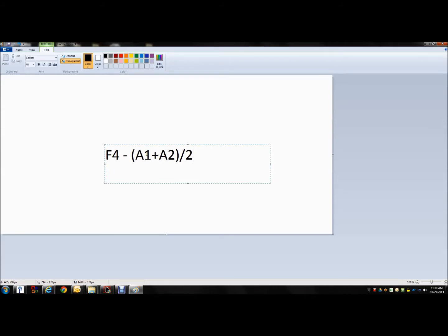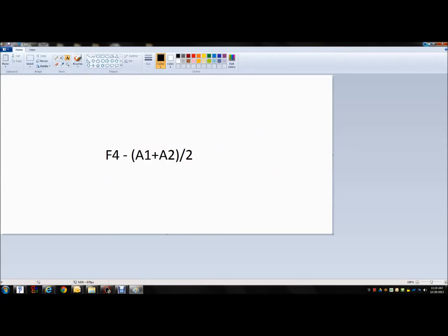It's a pretty neat tool. So remember that if you have a lot of EKG artifact in an ipsilateral ear reference, try using the linked ear, which is A1 plus A2 divided by 2. So you're getting the average of these two in input 2.